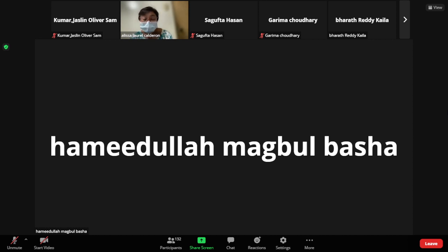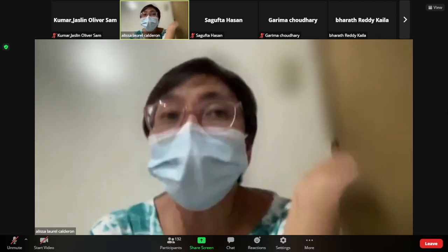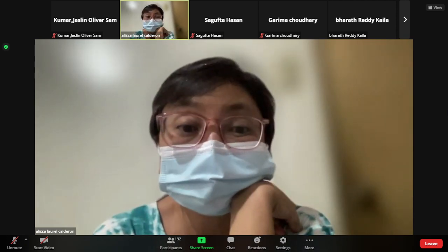Yes, Doc, but what my question is, we are placing the tuning fork in the middle. How can we say whether it is on the same side or on the opposite side, since you are placing it in the middle? Yes, you can. You just ask them, can you hear the sound equally on both ears?